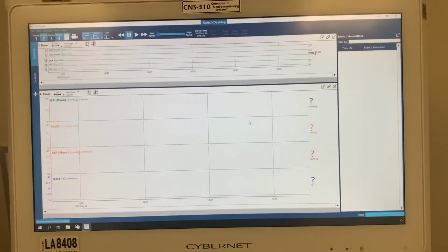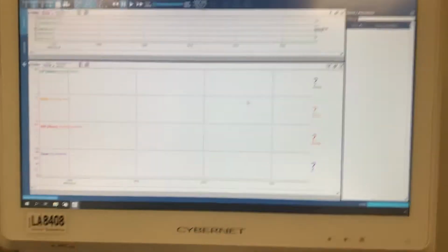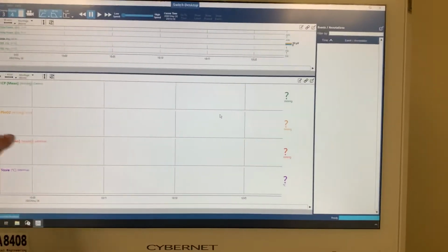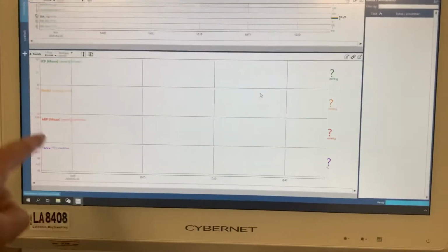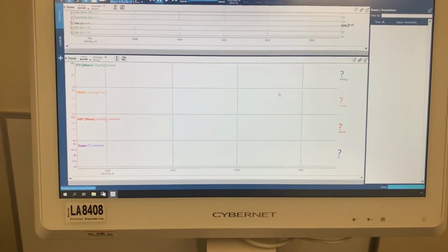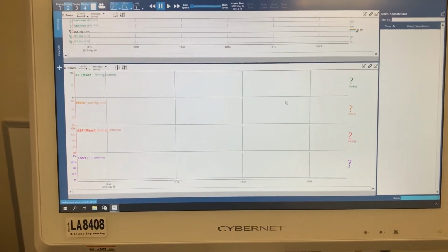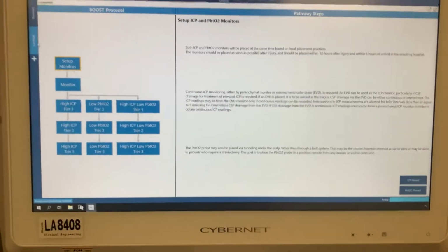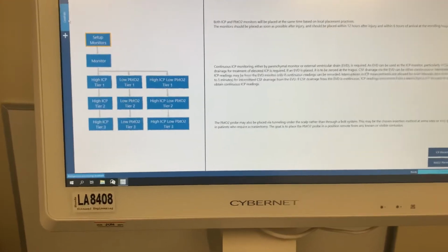This is probably the view that we'll use during the trial. And very similar to what you saw earlier, it's not as pretty, but you'll have the ICP trends, you'll have the PbO2 trends here, you'll have the arterial blood pressure trends, and so forth. And if the patient has a spike, an ICP, for example, above 22 for 5 minutes, what happens is something called care path comes up.